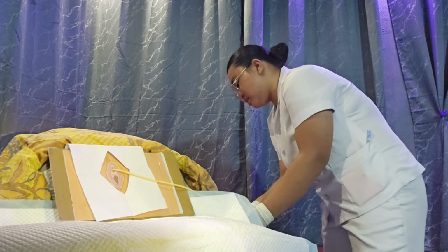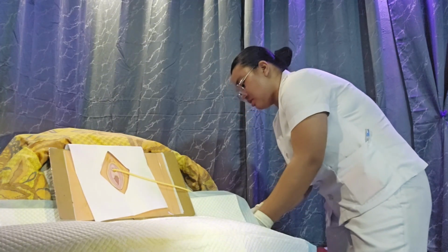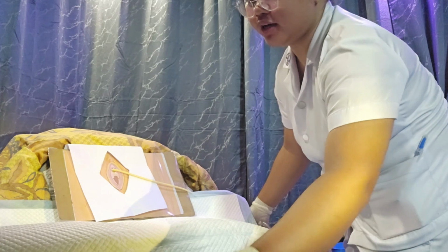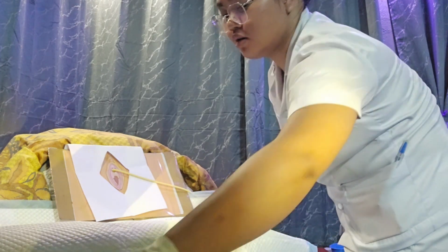So ma'am, isn't it too tight po ba or too loose? Okay. And then securing the bag onto the patient's bed.